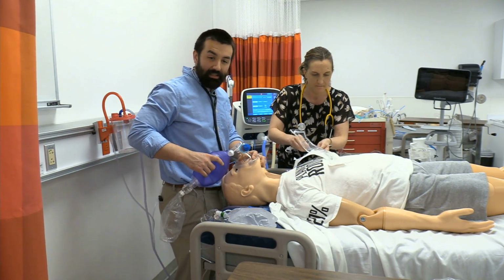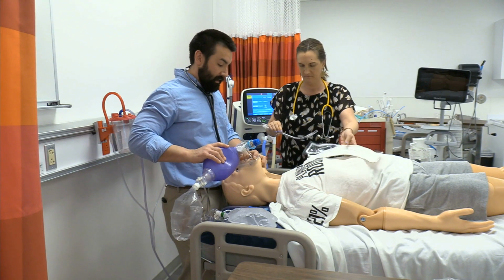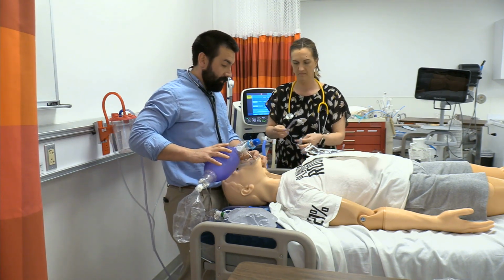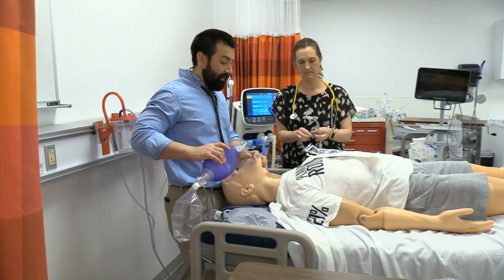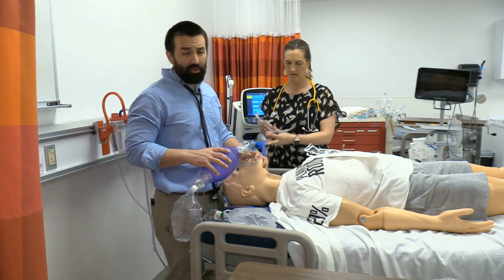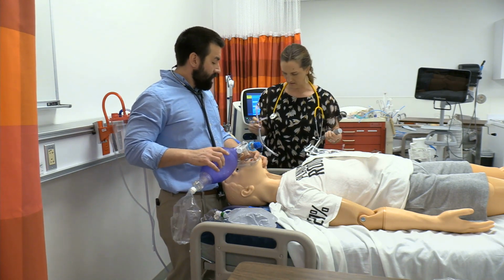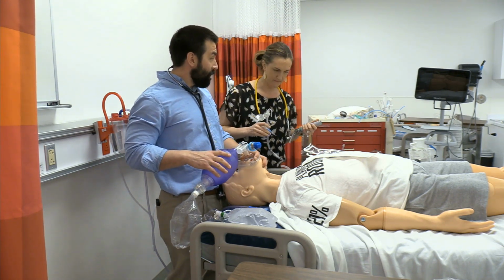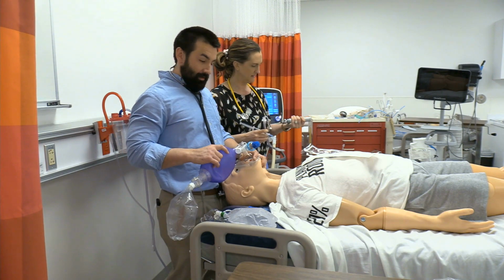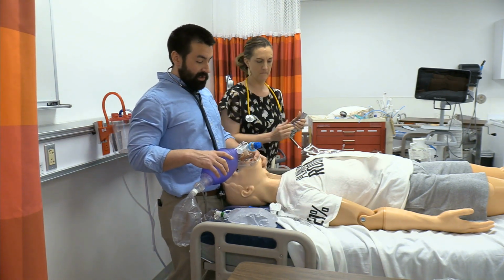Nice, easy breaths, okay, none of the crazy squeezing. You don't want to get this far and then have them vomit on you. Ideally, we're going to provide manual resuscitation until we get our saturations back up. These drugs are still going to be on board. Let's try this again. Yep, I got this. All right, so saturations are good, 99%.